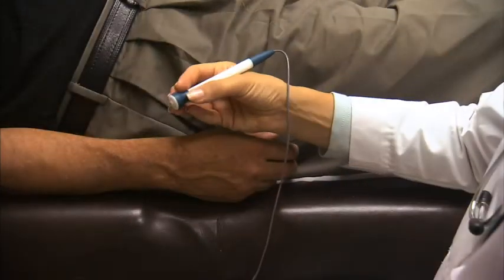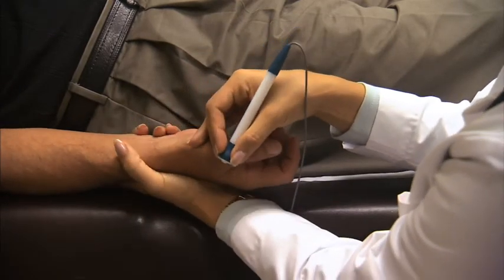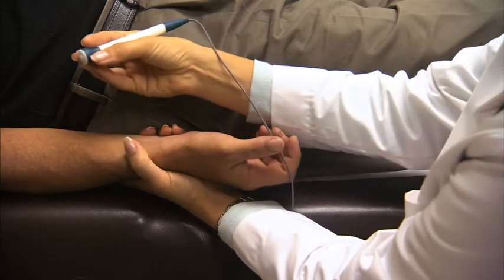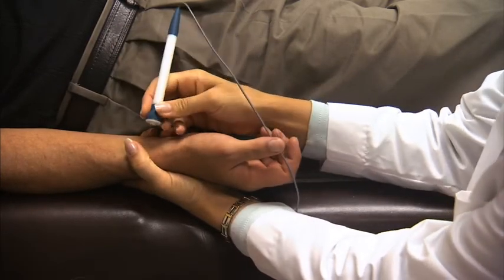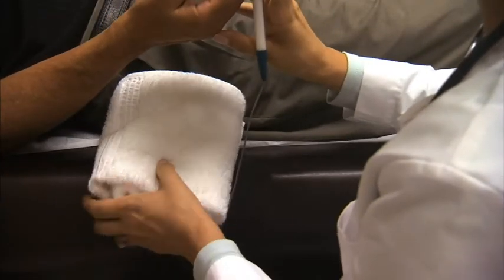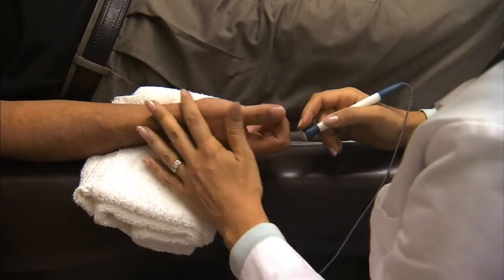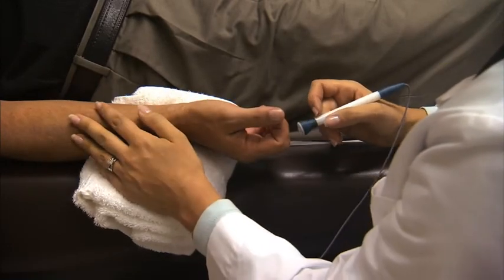Hold the tonometer in your dominant hand and use your other hand to support the patient's wrist, resting your arm on a stable surface. Allow a slight amount of backward flexion of the patient's wrist. You may use a small folded towel to promote this flexion, always making sure that the patient's arm and wrist are comfortable and not overflexed.